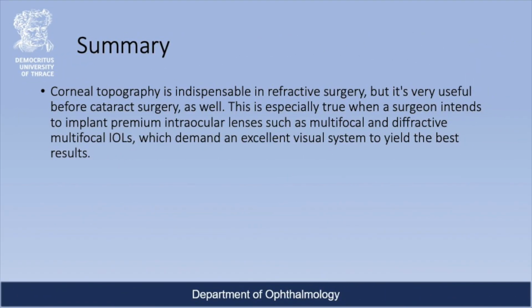To summarize, corneal topography is indispensable in refractive surgery, but it is very useful before cataract surgery as well. This is especially true when a surgeon intends to implant newer intraocular lenses such as multifocal and diffractive multifocal IOLs, which demand an excellent visual system in order to yield the best results.